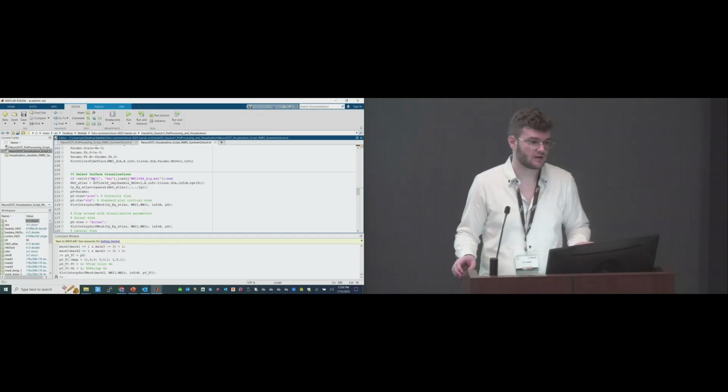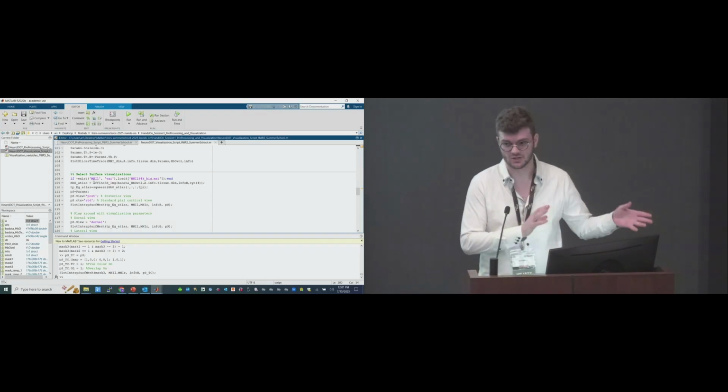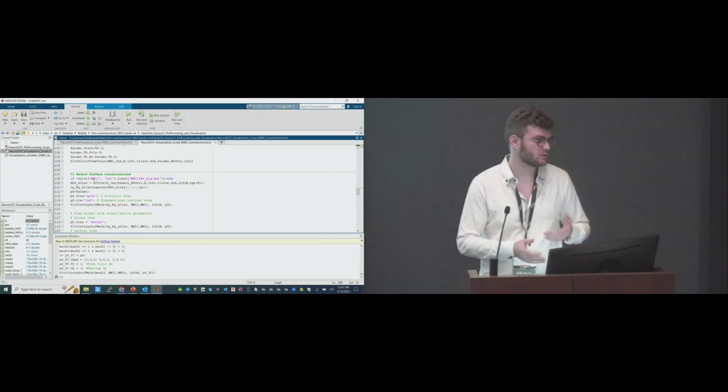For a lot of our stuff, as Adam was saying earlier, we compared to fMRI papers. We saw fMRI data, which is the gold standard for functional neuroimaging. We did a paradigm, we saw that there was activation in certain areas, and then we did our analyses and modulated our visualization parameters so our data would match as closely as we could.